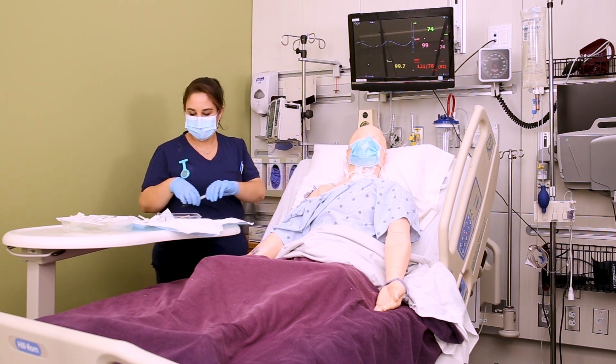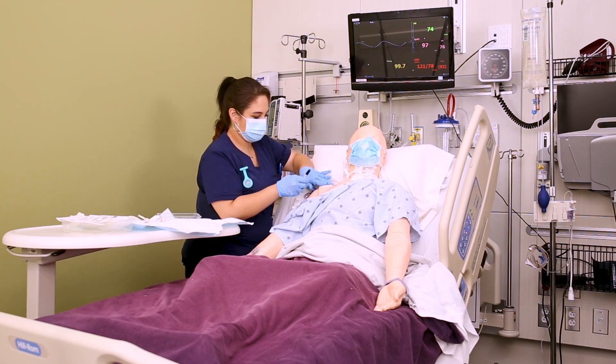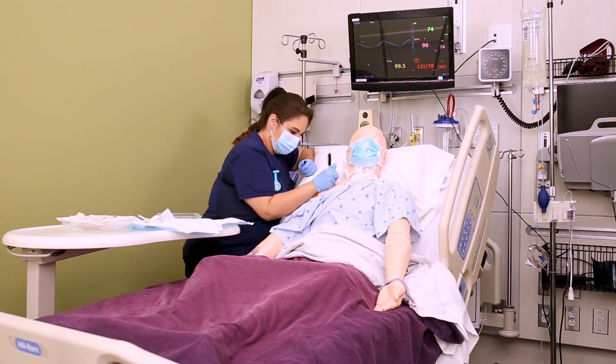Once you've changed all the caps, time, date, and initial your dressing. Sometimes the dressing comes with a little sticker for this purpose. Then discard your supplies and document what you did.